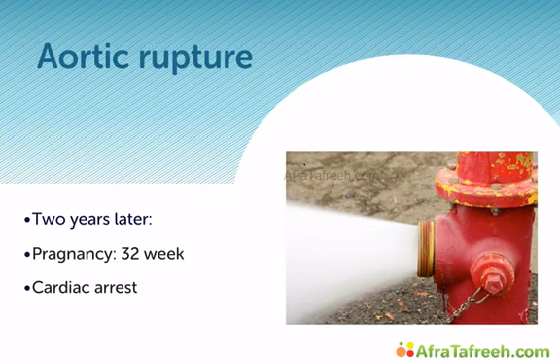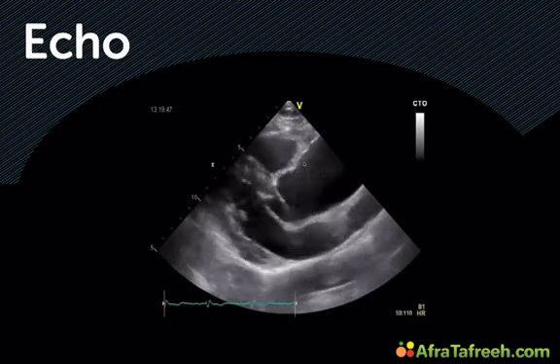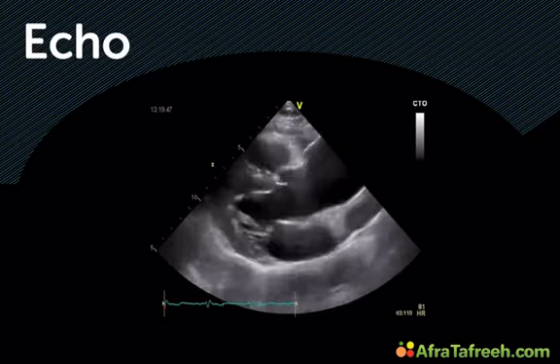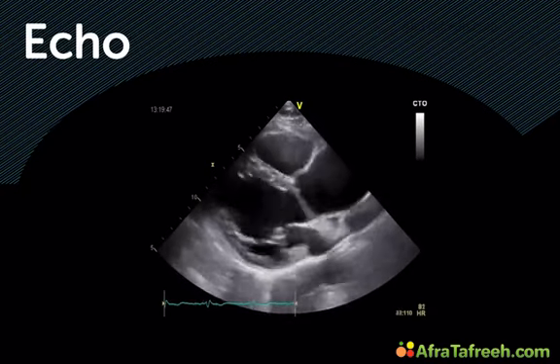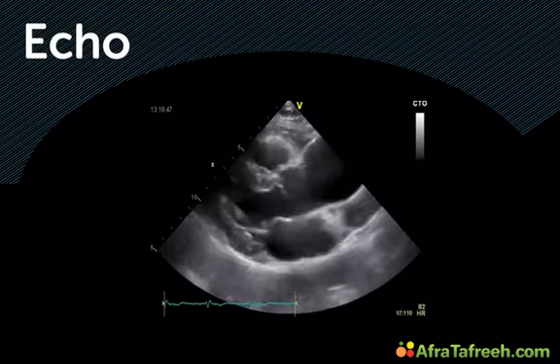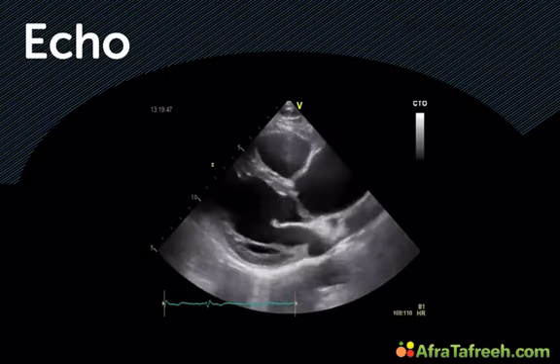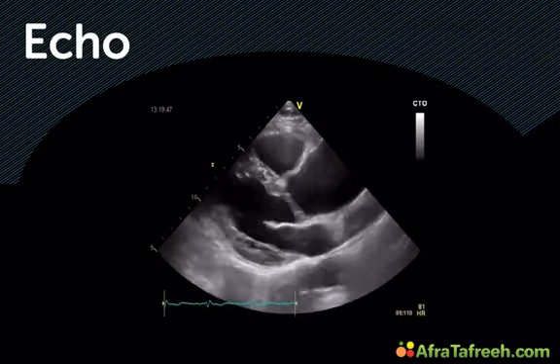But the key thing to remember here is that patients who have a dilated aorta are at high risk of aortic rupture, and especially those patients who have Ehlers-Danlos syndrome. Those, and also the patients who have Marfan syndrome, should probably go to surgery at an earlier diameter of the aorta already. Let me just show you a few other images of other patients so that you get a bit of a feel of how dilated the aorta can look.